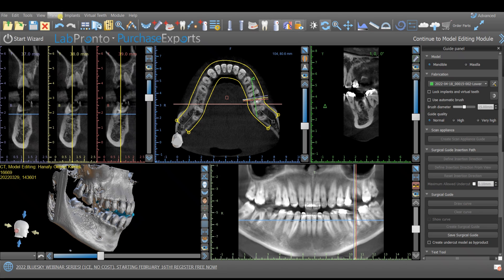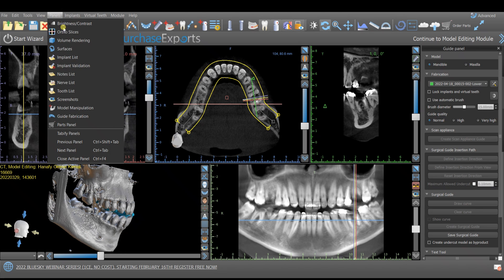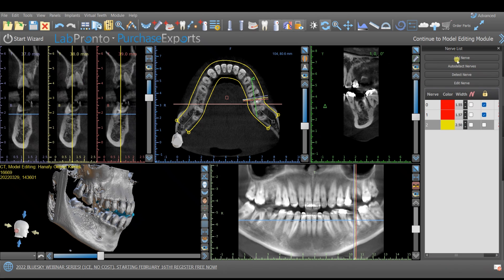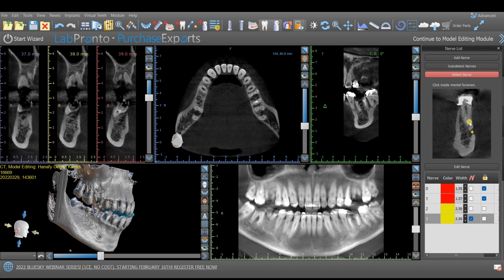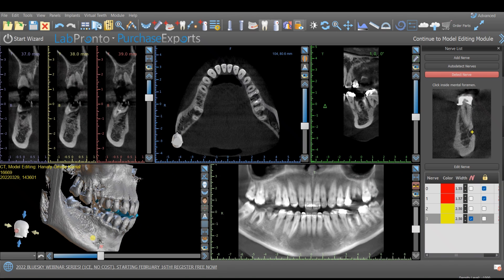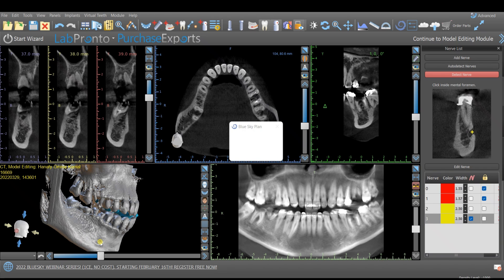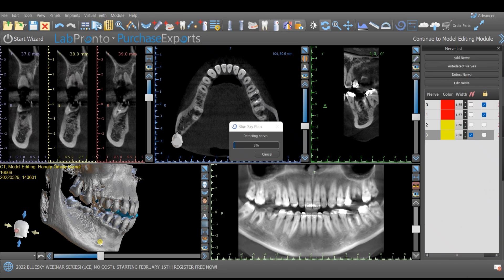We will go to Panels > Nerve List > Add Nerve > Detect Nerve. We will use the 3D view by clicking on the mental foramen here, and the software will auto-locate the nerve.